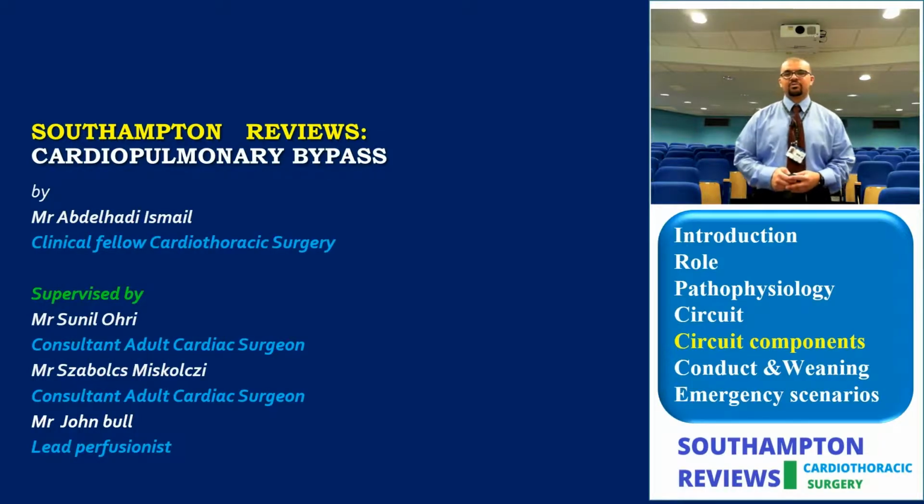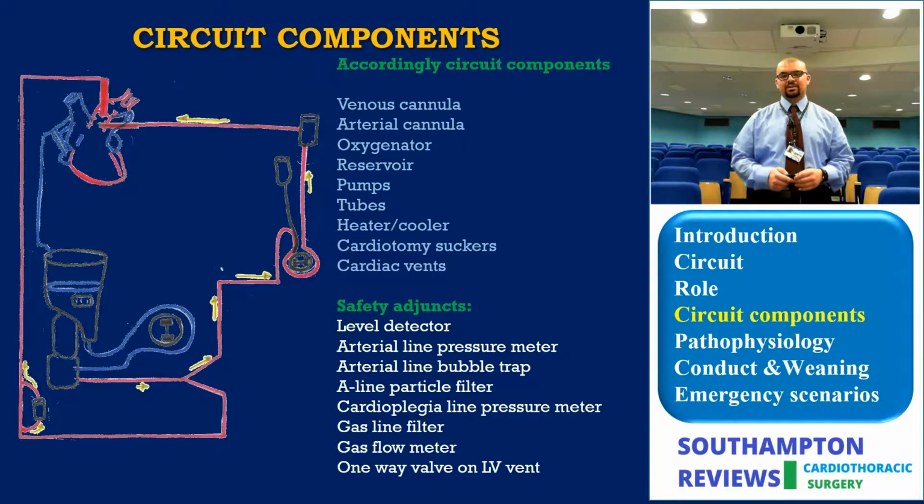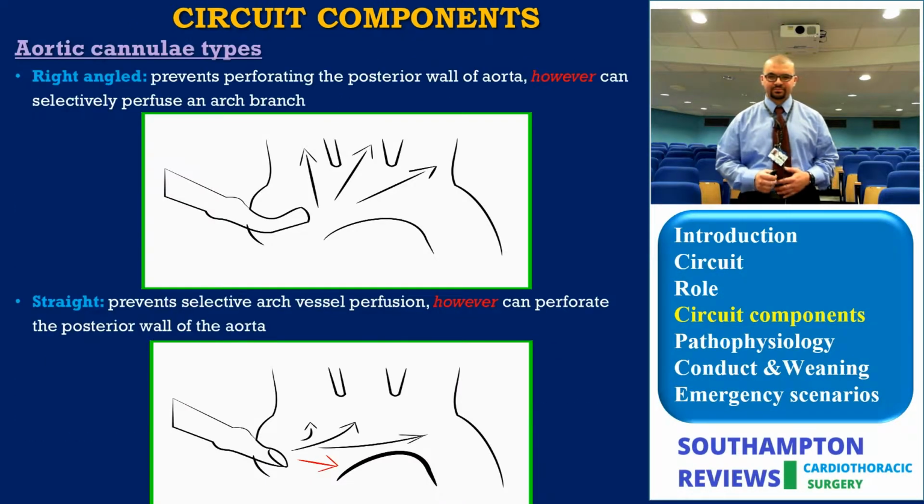Welcome back. Now we will be discussing in more detail some of the circuit components. This is a list of the circuit components as they are written in most of the books. We will start with the aortic cannulae.